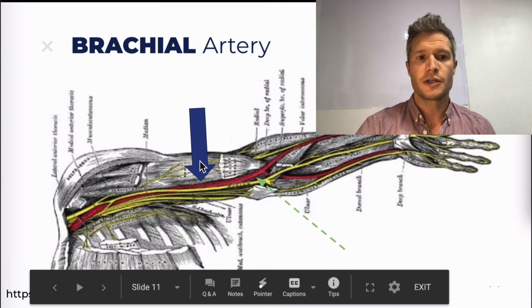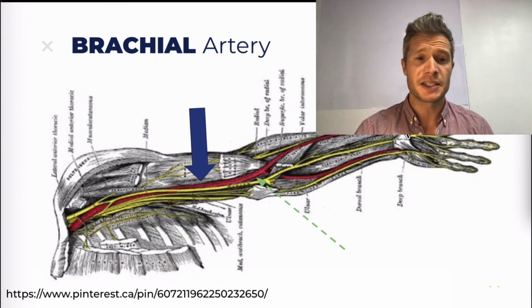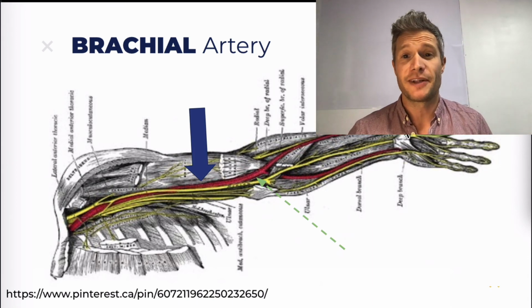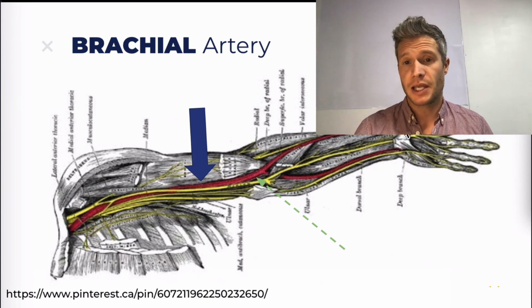So the blue part is where you apply the cuff, and it's going to inhibit the blood flow to the rest of the arm. So when you're doing these, big safety alert, should have some graphics or something fly up there. Don't leave the blood pressure cuff on for any longer than, let's say, a minute at absolute most if you have to, okay?